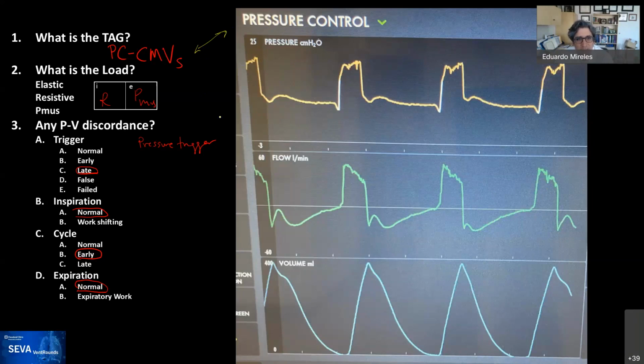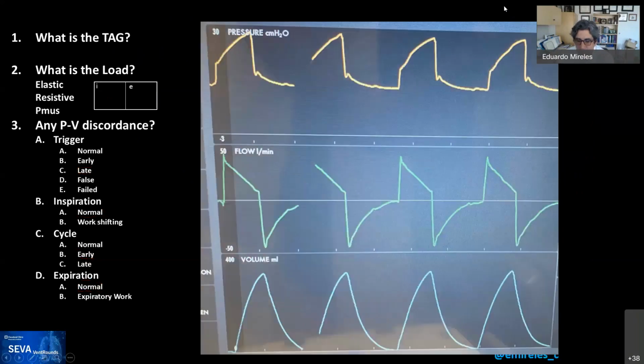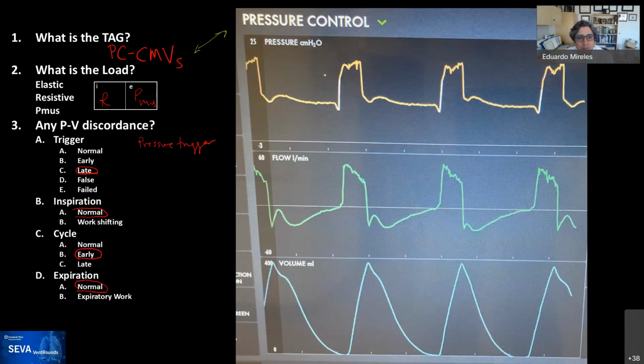And that's the benefit of knowing your ventilators and learning the tags, because then you know exactly what tag your ventilator is. So I suggest that you grab one of our Rosetta cards, as we call them, or tag cards. Or if you have one and you need to know more about these vents, we're happy to share with you so that you know what your ventilator is doing. And then you just memorize them, and it comes naturally, and you will know what it's doing.